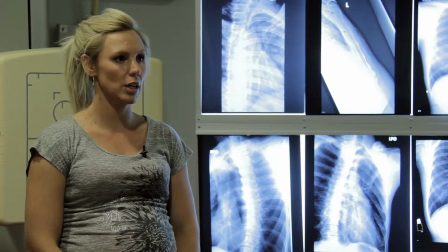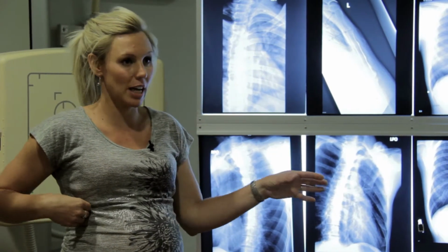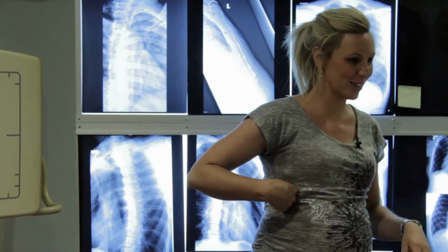3 upper rib pictures. Just because they're laying down doesn't mean you all of a sudden roll over into lower ribs. If they're having true upper rib pain, but you happen to have to lay them down, you can just do the upper rib protocol. So you'll still follow all the rules for upper ribs.